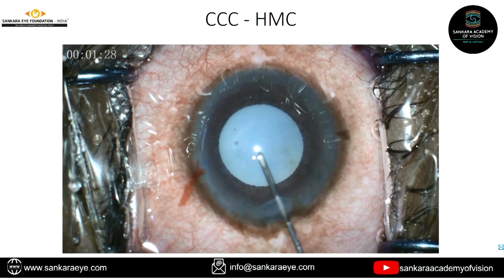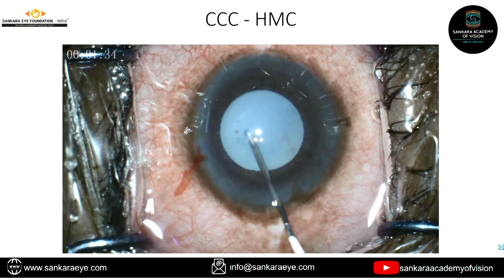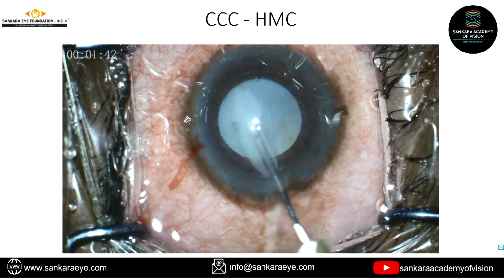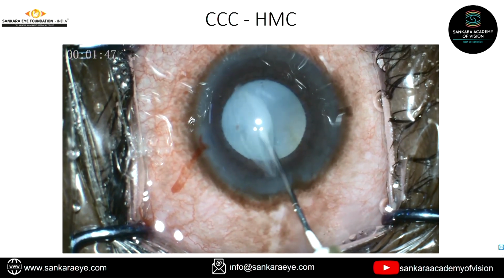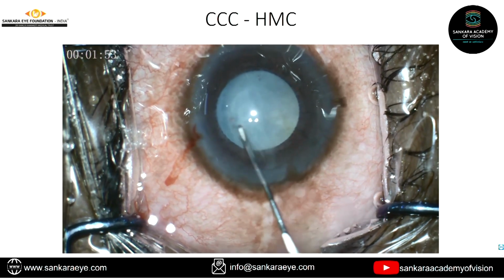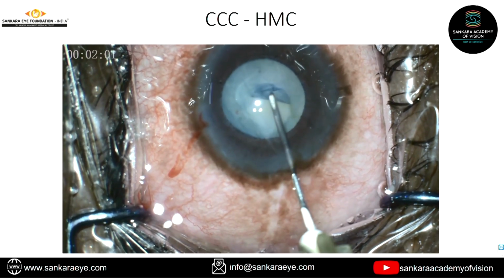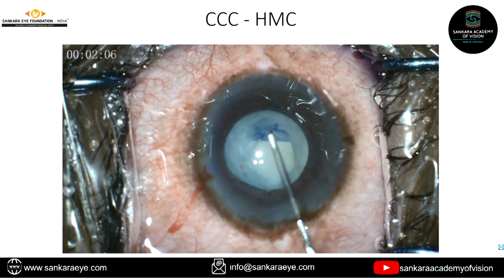Next, in a hypermature cataract, you know the fluid is going to leak. So I've connected my 26 gauge needle to irrigation fluid. You can see fluid coming out now. You decompress the lens, and all the liquefied material comes out. You can see the liquefied cortex coming out, and once it is out, you can see the hard brown nucleus behind it. So wait, and now with the flow, you can try to do a rhexis. In this one, as I start the rhexis, the superior area is okay. Once I cross the superior 12 o'clock and come towards the nasal side, that's when the rhexis tends to extend.